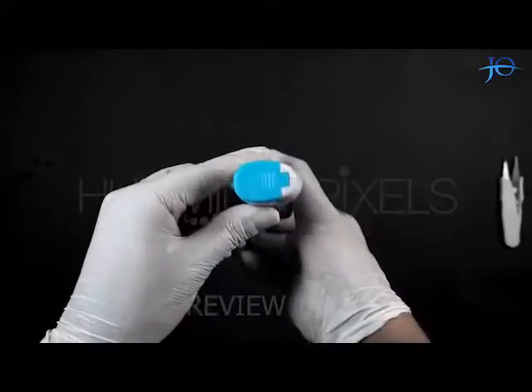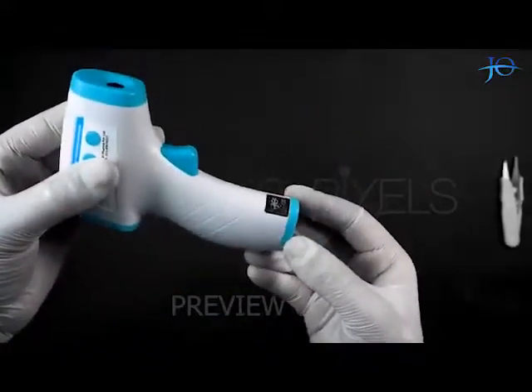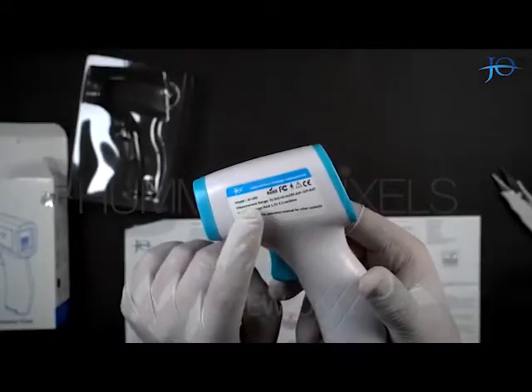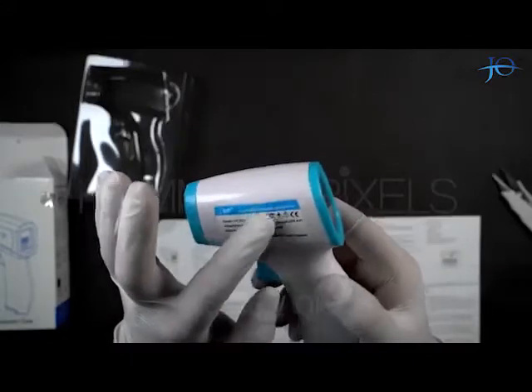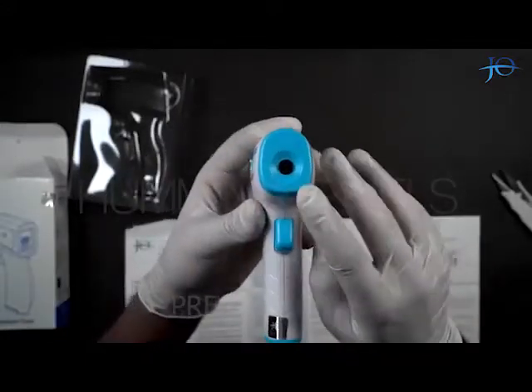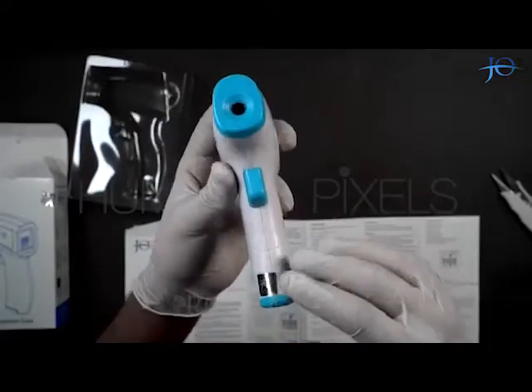The quality of the material used is good. There is a hallmark on the device with the Joe Pharma logo and manufacturing date on it. The model number is also written on the gun along with the measurement and battery specifications. The sensor used in this product is made in Taiwan and is one of the finest quality and accuracy.